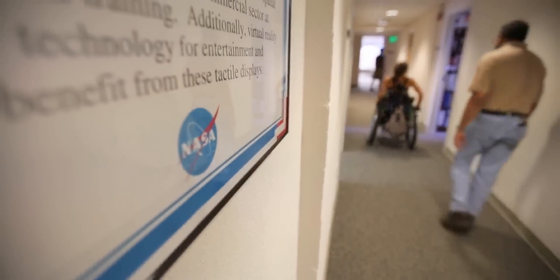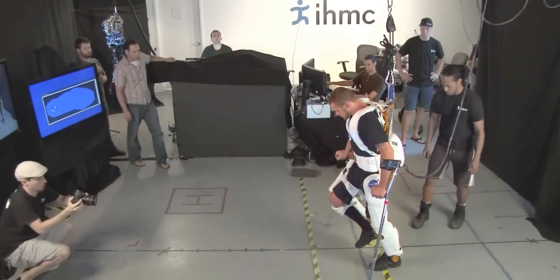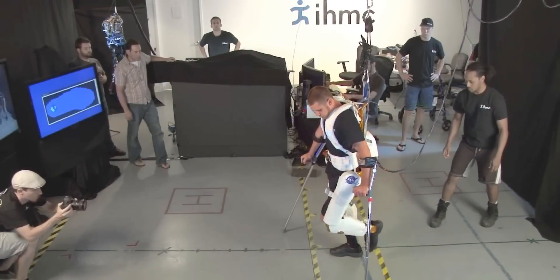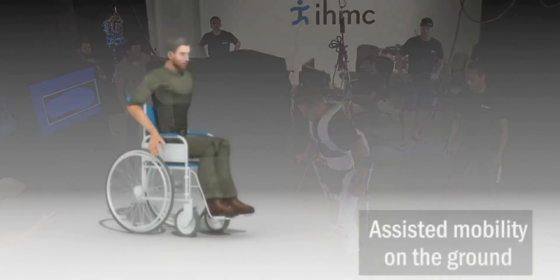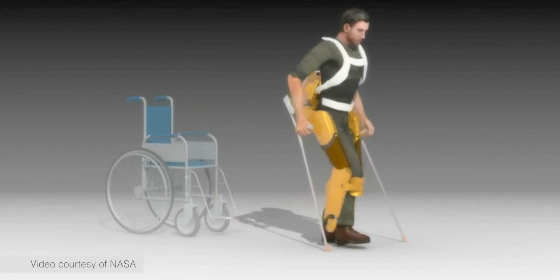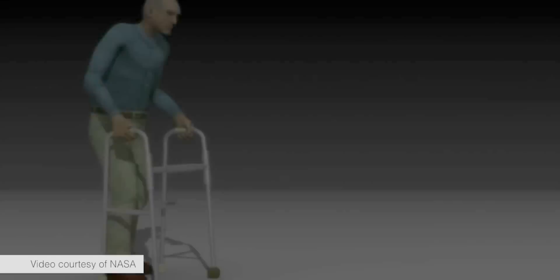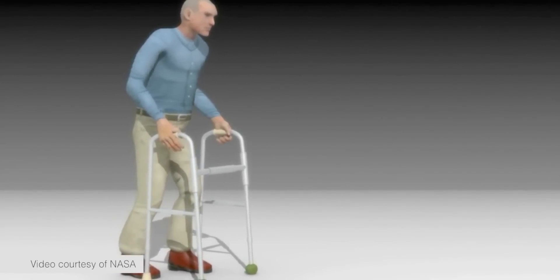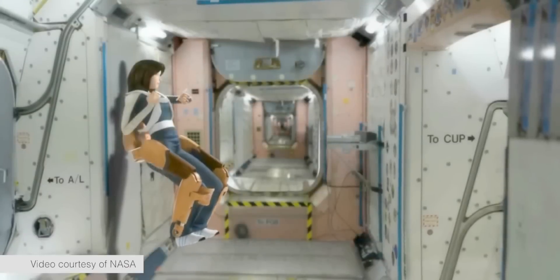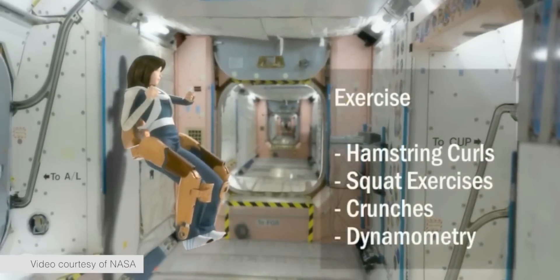The X1 device was designed to be a research tool for wearable robotic research. One application includes mobility assistance for someone with paralysis, but we also designed it for able-bodied users, where it can either provide assistance or resistance. Assistance is useful if someone is carrying a heavy load or has weakness or paresis.